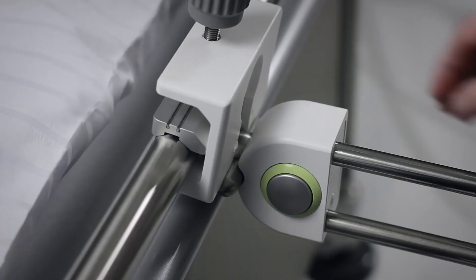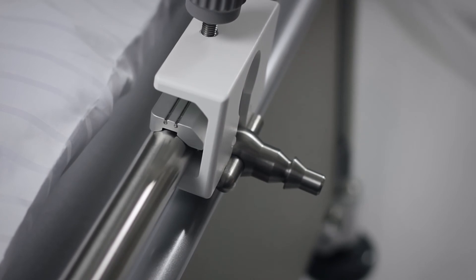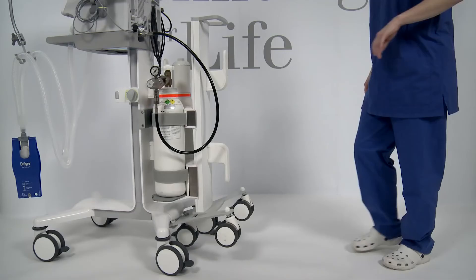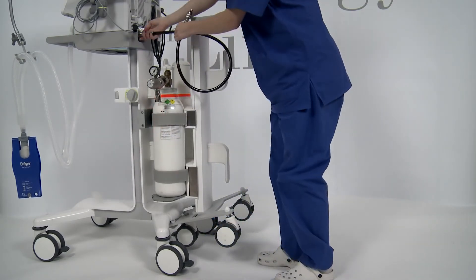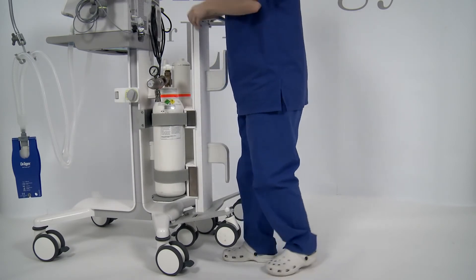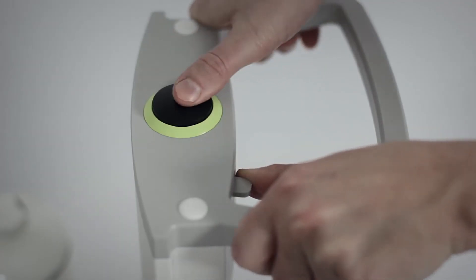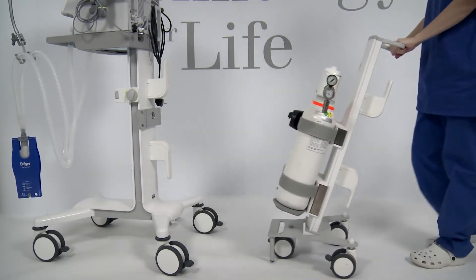To uncouple the device and the bed, press and hold the release button on the device side coupling part and detach the device from the bed simultaneously. To decouple the transport supply unit, lock all brakes on the trolley of the ventilator. Hold the transport supply unit by the handle and move the locking lever to the left while pressing the locking button. Move the transport supply unit from under the trolley and park.